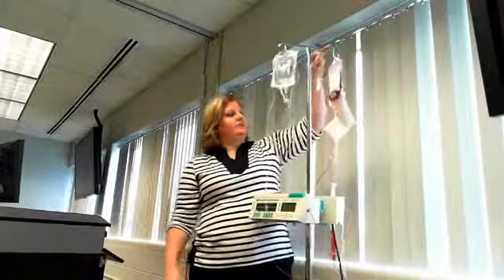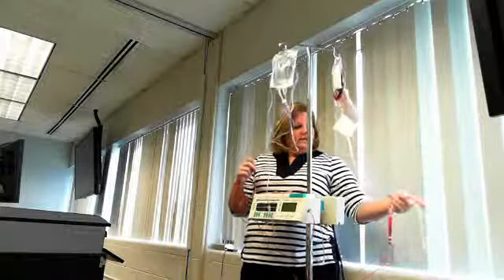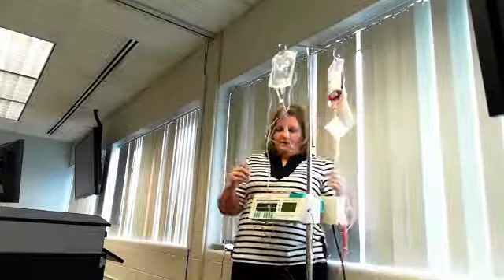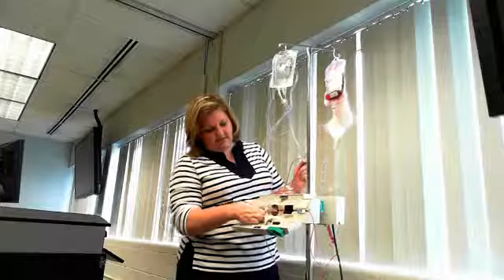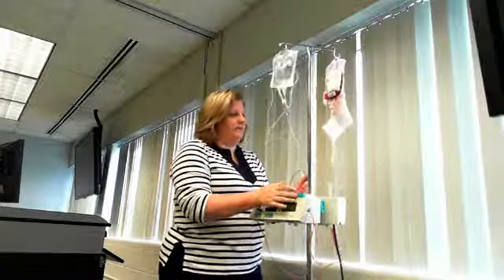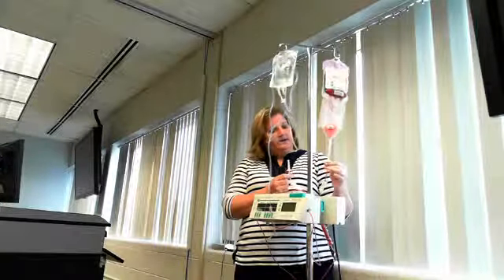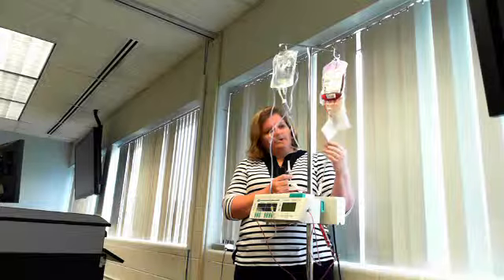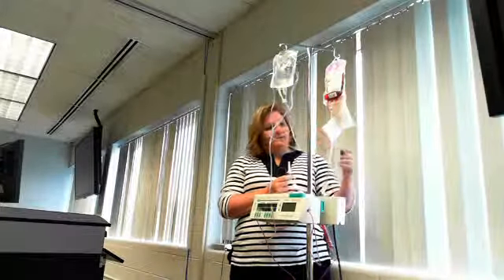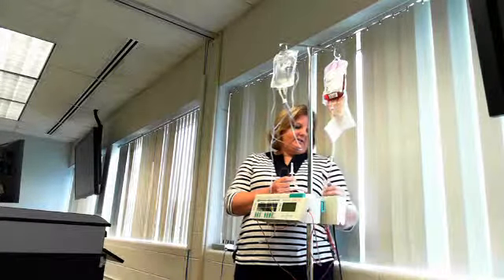The blood tubing is received when you pick up your blood. It has two spikes, a filter, and the rest is similar to a primary IV set. There is also a connector between the blood and the IV tubing called a leukocyte filter, used when patients have had transfusion reactions in the past — it pulls out white blood cells to help reduce reactions.